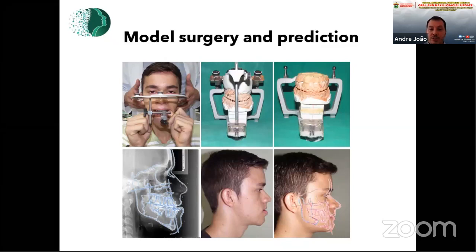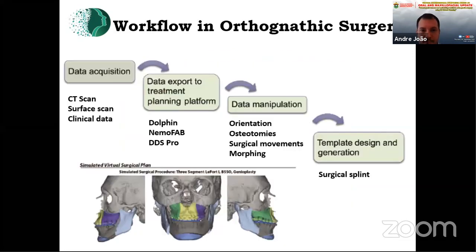I think to perform a very good surgery, you need a surgeon who dominates all the steps of this procedure. Before, we had to create the physical model of the patient and put it in the articulator. Now everything became digital.